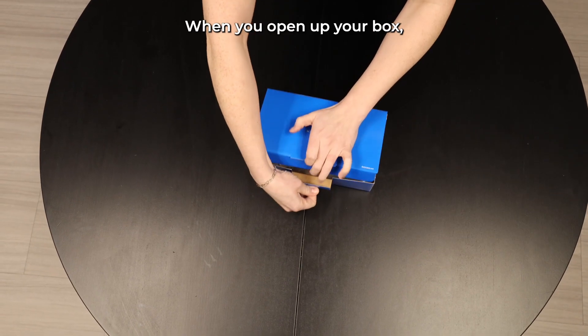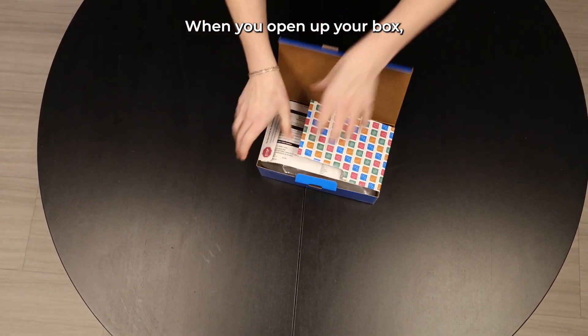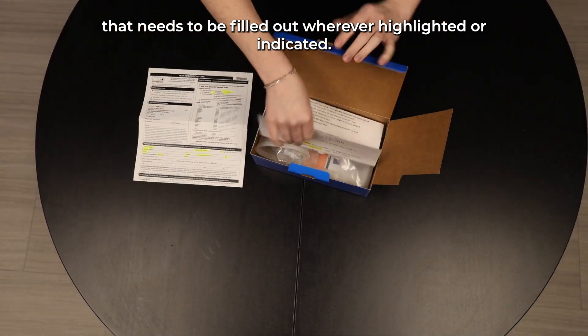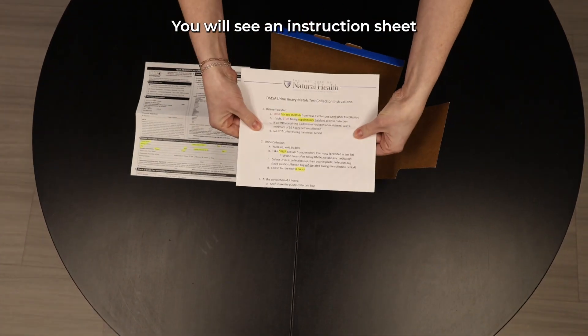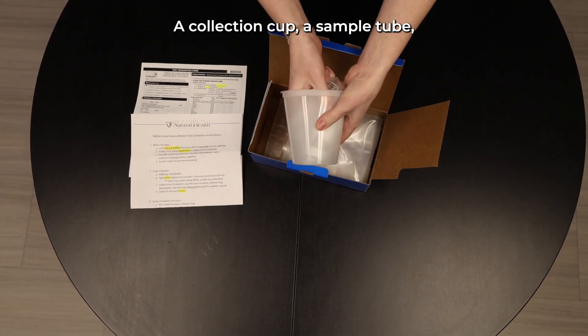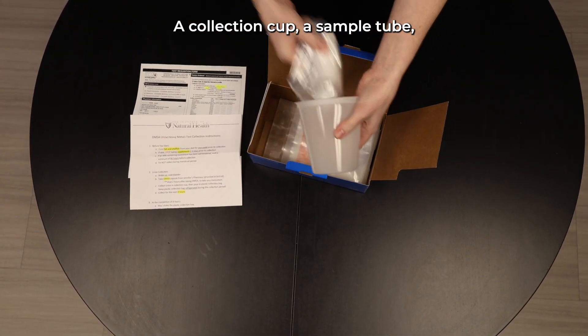When you open up your box, you will see a test requisition form that needs to be filled out wherever highlighted or indicated. You will see an instruction sheet that will show you how to complete your kit, a collection cup, and a sample tube.